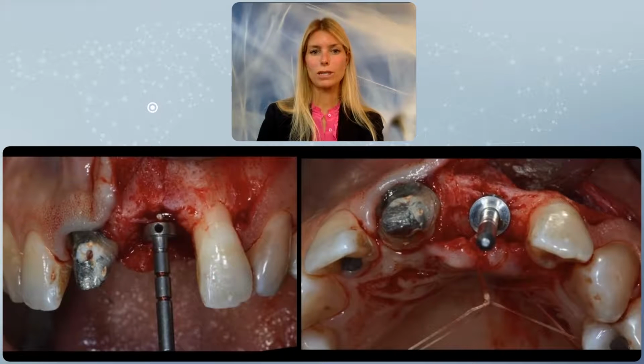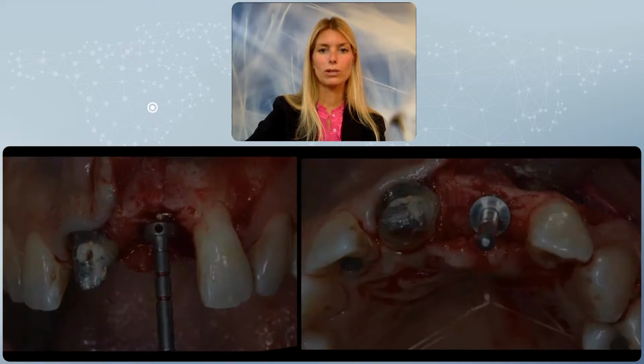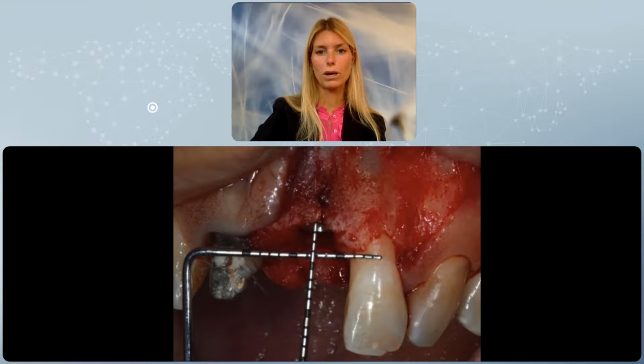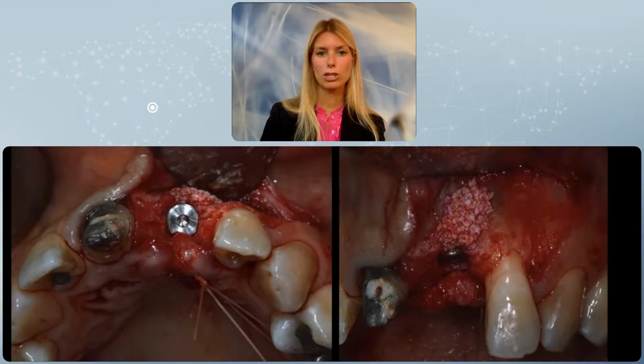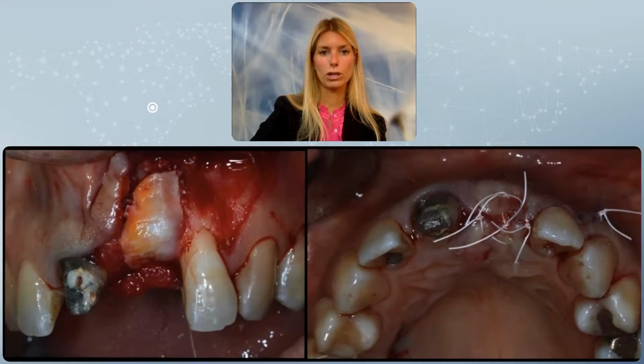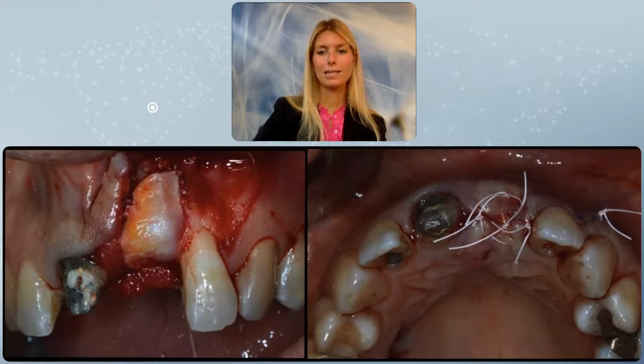When the implant is positioned in the right 3D position, we can see already a crack in the buccal alveolar bone, and we can see that there is a slight dehiscence. So we perform a traditional, straightforward, horizontal GBR in conjunction with implant placement, where the particles are gently positioned and adapted without necessarily over-contouring the area, and following again the biological principles, we cover this with a collagen barrier membrane and a connective tissue graft overlying on top to be able to achieve a nice aesthetic result.